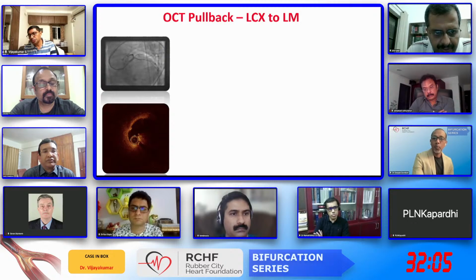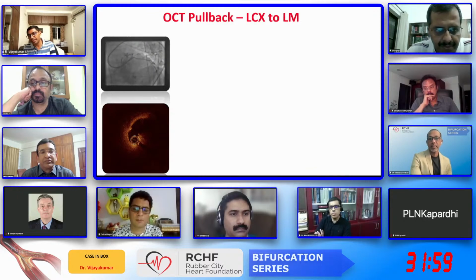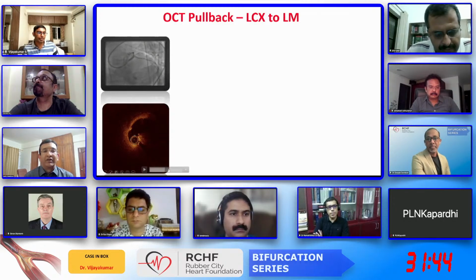Yeah, because we were not sure whether you will be able to track the catheter. So we thought, let the lesion be prepared well. And again, to avoid too many OCTs, suppose if you find something, then again you have to do it. That's why we thought, anyway, it looked like an angiographic 3 millimeter vessel. You just prepare with the 3. If it is bigger, then again we can go ahead with the bigger balloons here.